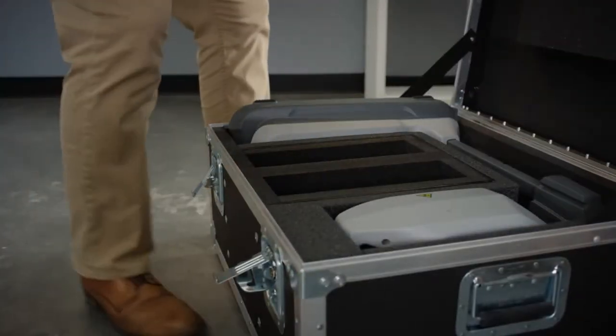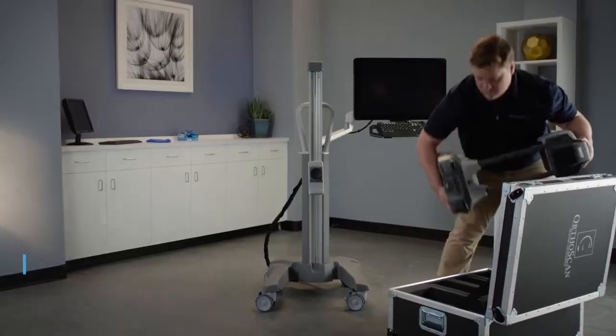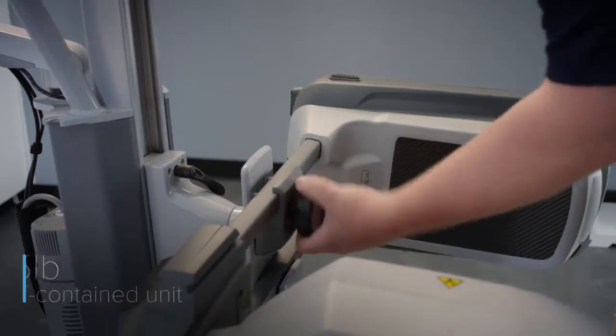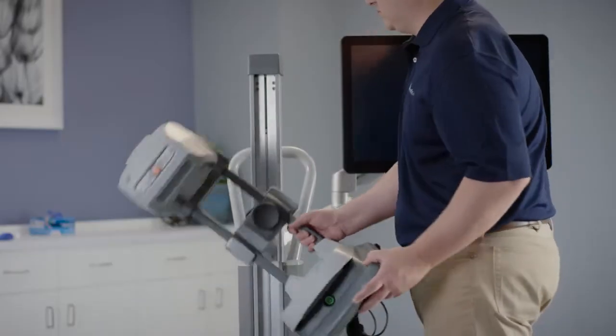Mobile DI quickly unpacks and mounts onto an optional accessory cart. This cart allows you to effortlessly move the unit within your office and achieve versatile and dynamic views of anatomy.